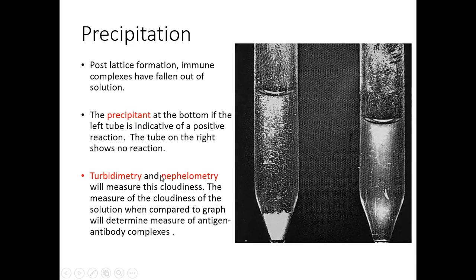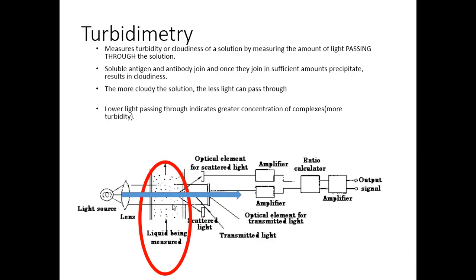As I just said, turbidimetric and nephelometric testing is going to take a look at the cloudiness and measure it. So turbidimetric, or turbidimetry, it's harder for me to say this. That's honestly why I say turbidimetric, because I have a hard time with turbidimetry. Honestly, I have a hard time with that word. I avoid it at all costs.